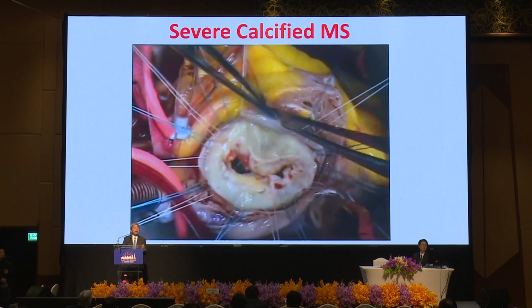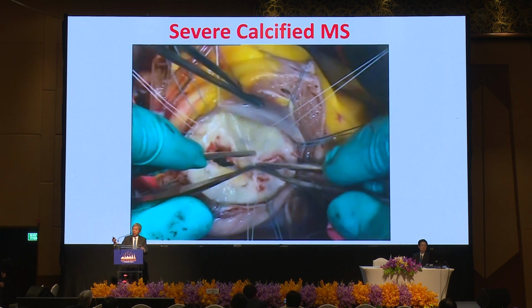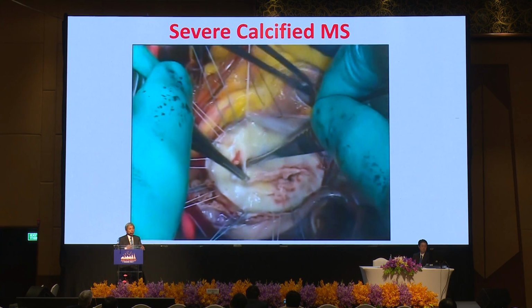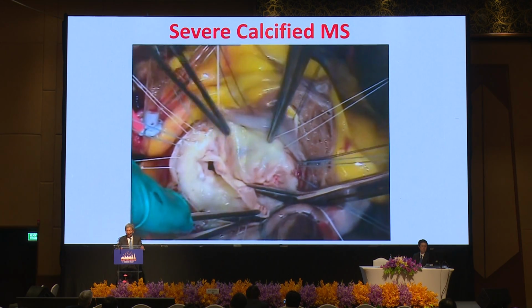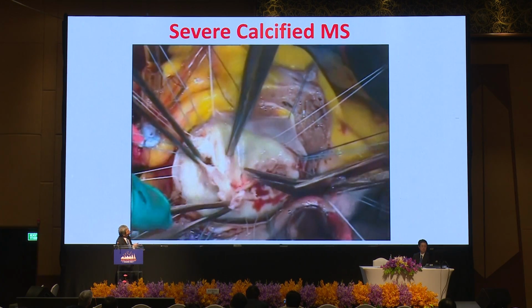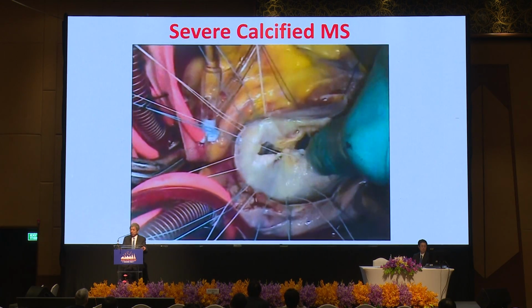Peeling is something that we learned most from Sampat Kumar, and then we modified it and made it very aggressive, trying to peel up to the rough zone. And then we cut at the rough zone like that. And you can see immediately that the leaflet tissue beneath is so good. And then it will do the job better.